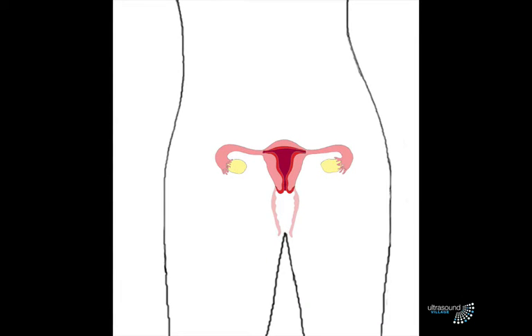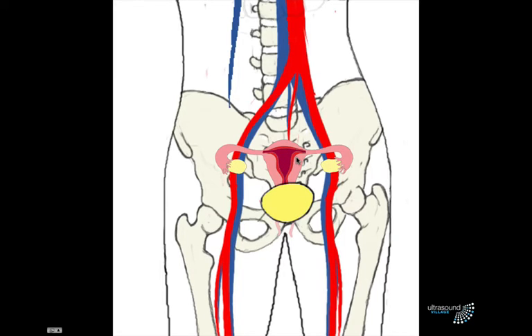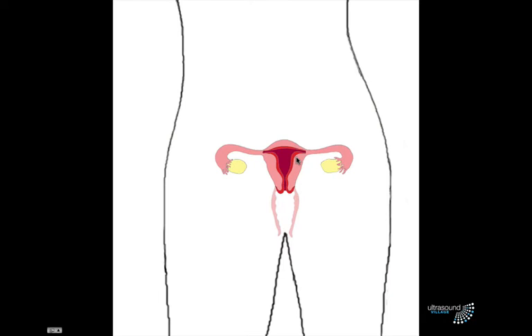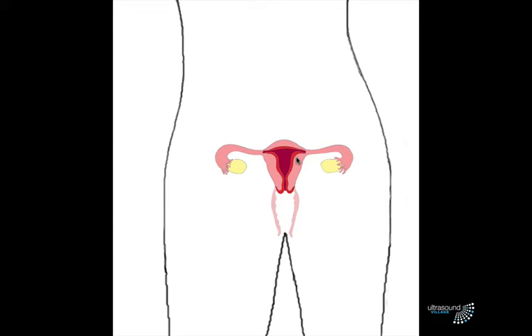You've got the female pelvis here, vagina, uterus, tubes and ovaries. But the problem is there's bone in the way, and often bladder, and there are blood vessels around. There's large bowel, small bowel, and sometimes that small bowel sits in front of the uterus. But not only that, to make things more difficult, sometimes the uterus sits one side or the other side. And those ovaries can move all around either. They can be anywhere. And as you can imagine, ultrasound then gets a bit tricky.